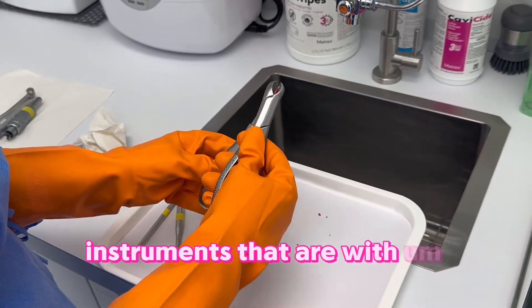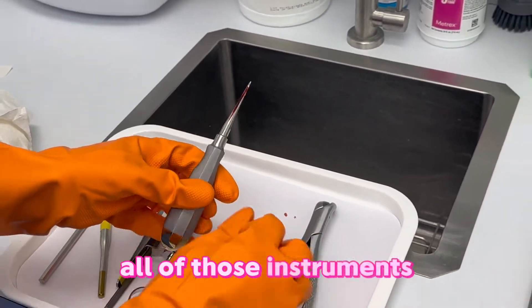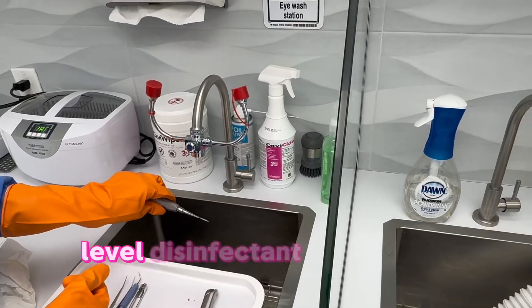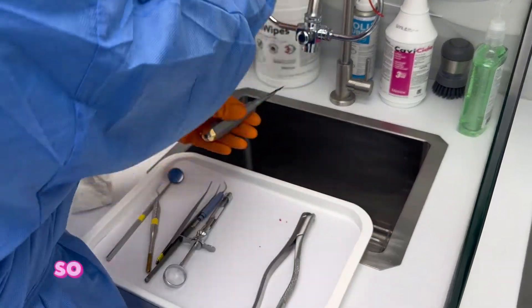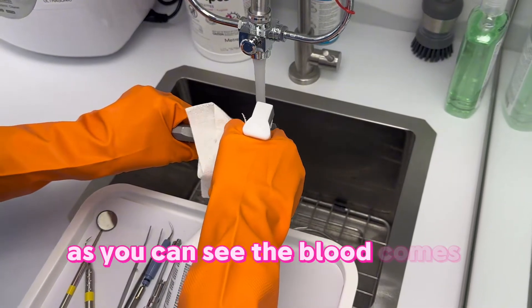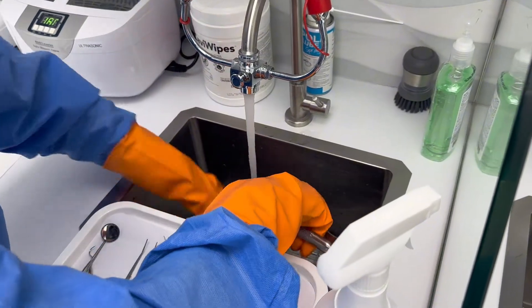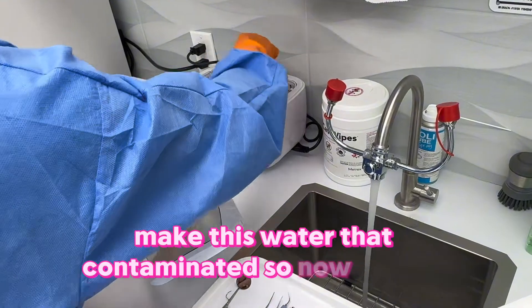Instruments that have blood on them, or if the blood has dried and is cakey, we're going to try to avoid putting them directly into the ultrasonic cleaner. What we do is spray a little bit of the intermediate level disinfectant and rinse them out before putting them in the ultrasonic with the rest of the instruments. As you can see the blood comes out, so we don't contaminate the water as much. Now they're good to go.